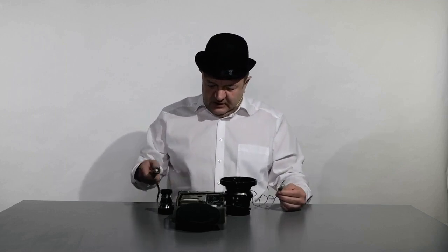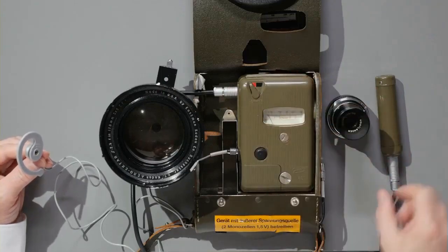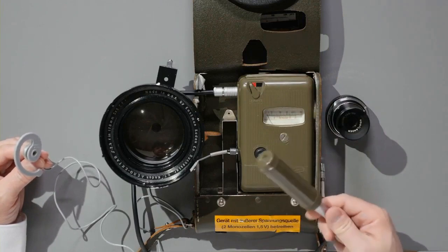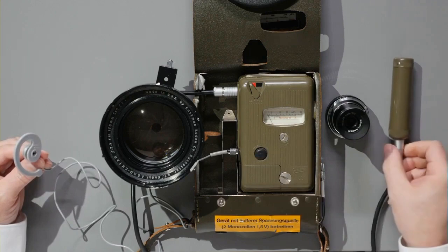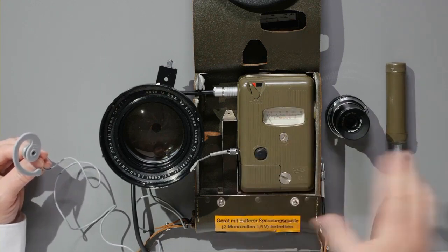What do we have here? Here is the Geiger-Müller counter. This element here is a bit greenish. This is a probe, that is, this element that I'm moving to the object being examined. Of course, such a leather or almost leather case and two camera lenses.